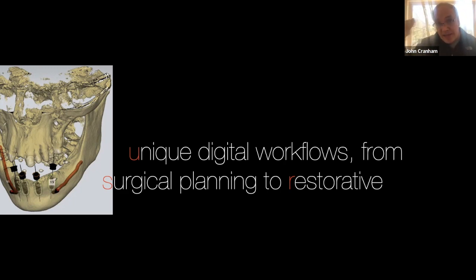And then at that try-in, they do the printable try-in, then you do a full series of photographs again. And from that point, we're off a little bit. And again, with these things, it's 3 appointments. It's kind of amazing. I've really been impressed with that workflow. Again, I'll find somebody. I'm getting this stuff from Ivoclar. I have not done one from scratch yet with the little triple tray and the face bow and all that.